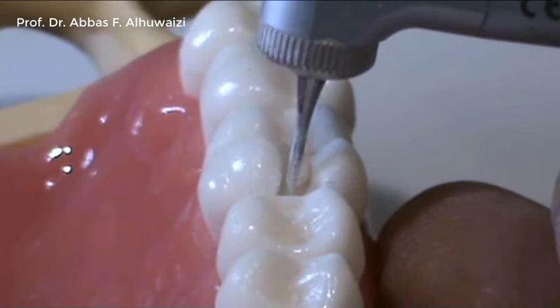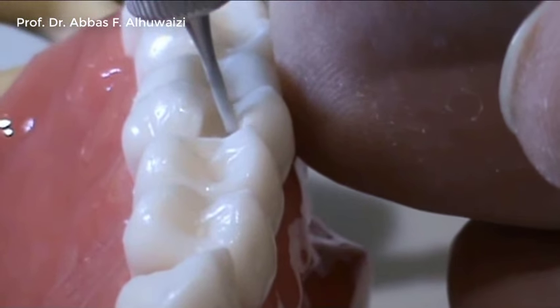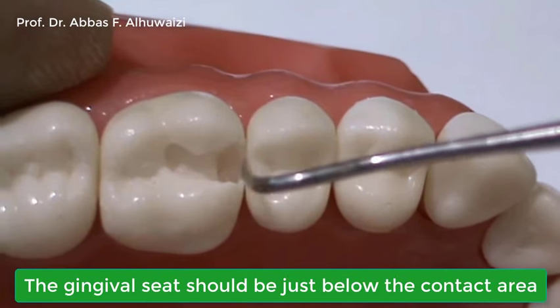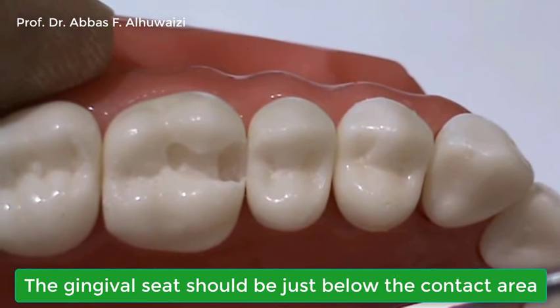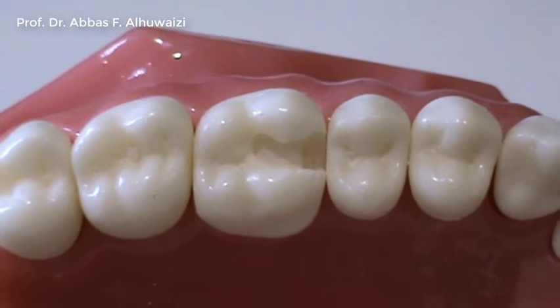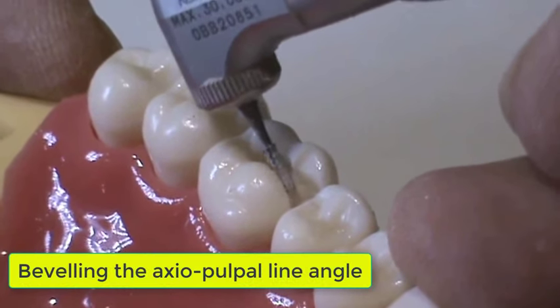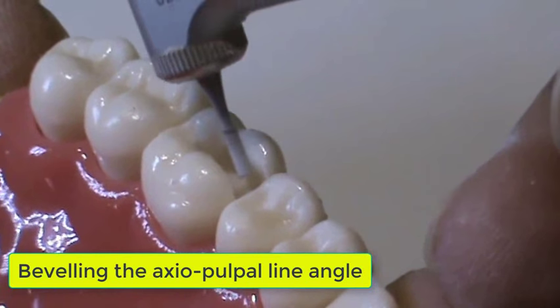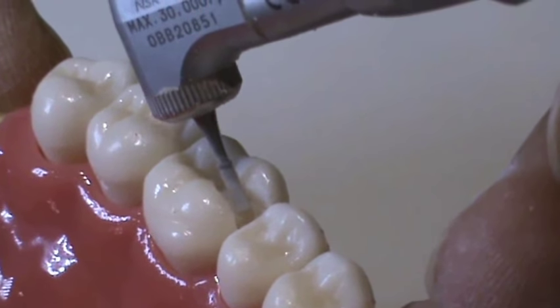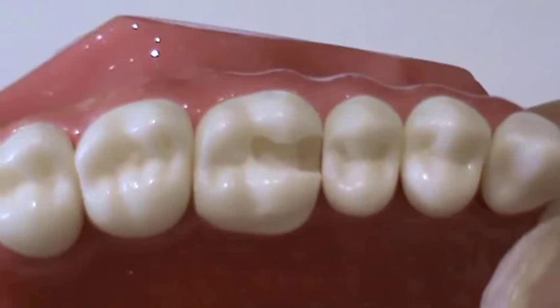The walls of the Class 2 box should also be converged occlusally and diverged proximally. Step 4: By holding the Fissure Burr at 45 degrees, we bevel the Axial Pulpal Line Angle — and now the cavity is finished.